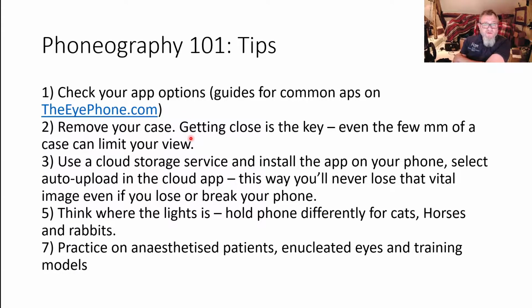Take the case off your phone. Getting your phone close to the eye is key, in the same way as getting your ophthalmoscope close to the cornea is the key to a good fundic view in close direct ophthalmoscopy. So even a few millimeters of your case can actually make the difference between a good or a poor photograph.